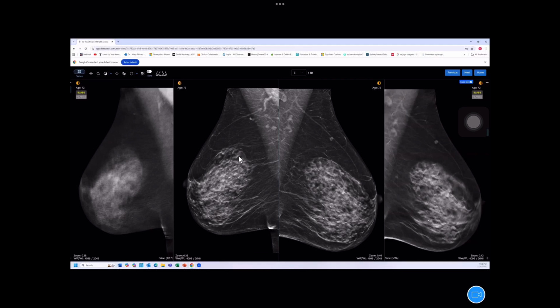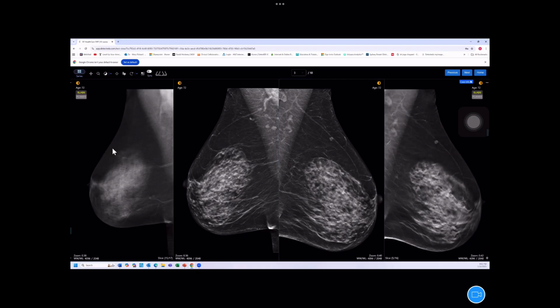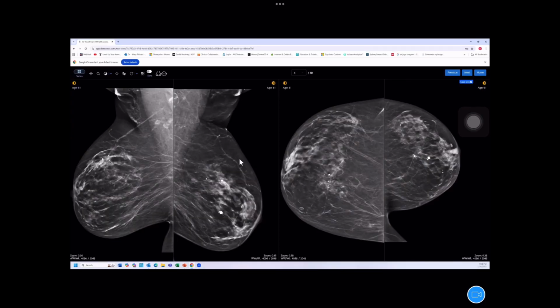And apart from seeing that normal lymph node with the hilum nicely shown, we're not seeing anything that would worry us. And I won't go through all the slices because this is in fact a normal case, but it does allow you to move through the tissue planes quite easily, and certainly at the level of the nipple you're getting a nice sharp demarcation of the various tissue structures. So easy to see that this is nice normal tissue. So we'll move on to the next case, case 4.